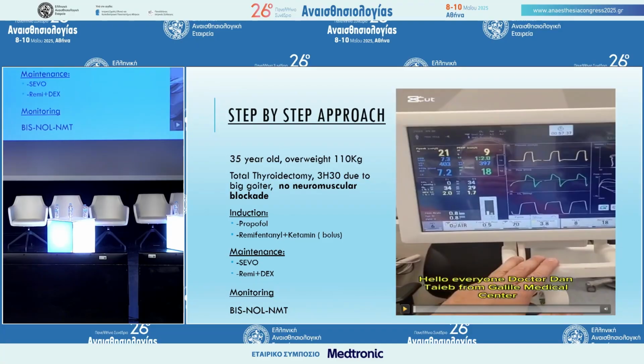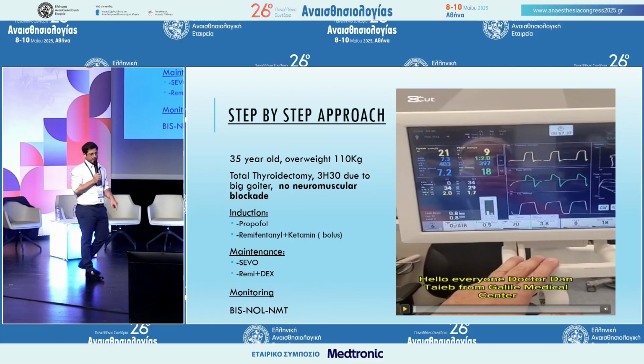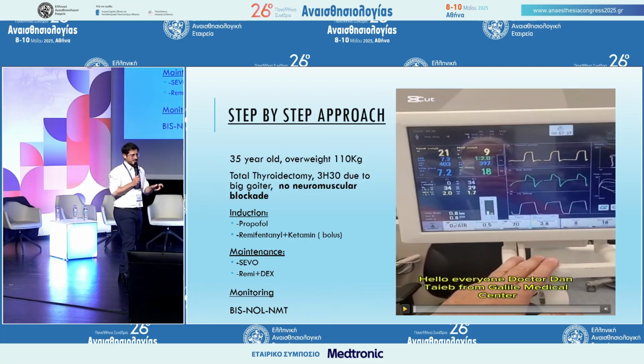In this video, I just want to share with you the step-by-step approach, and we will have a little exercise of how the NOL monitor is working. Very simple. So you can play the video.